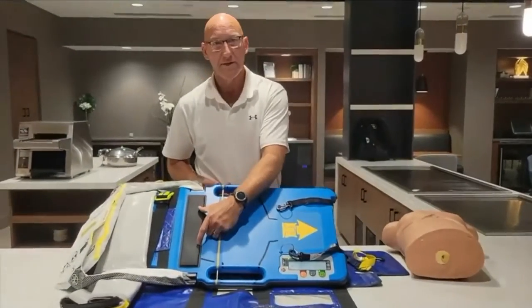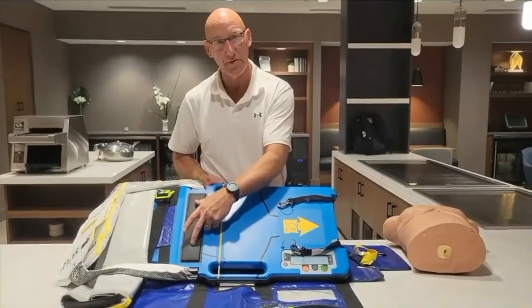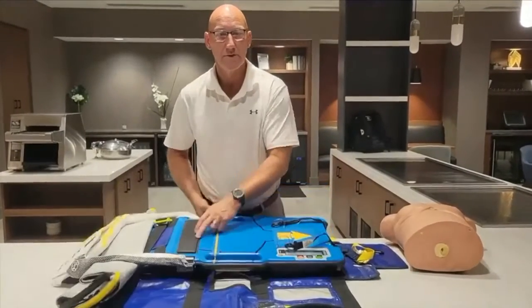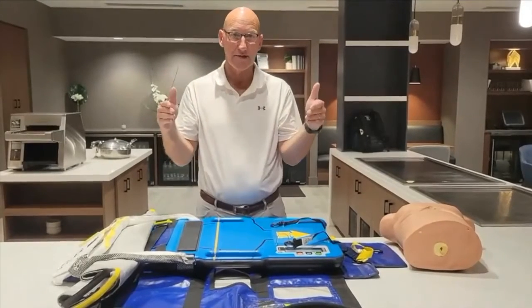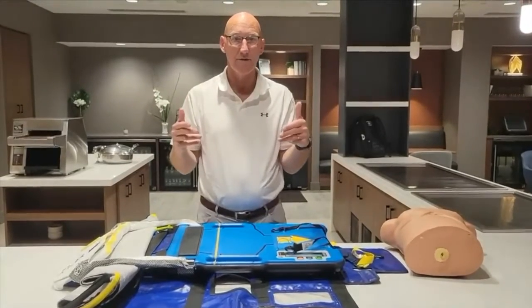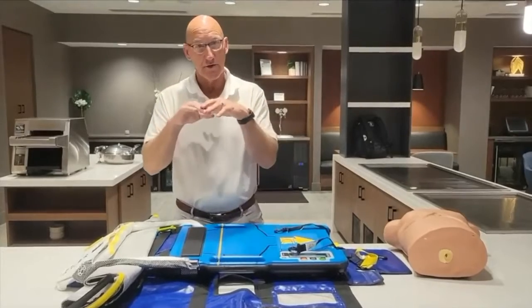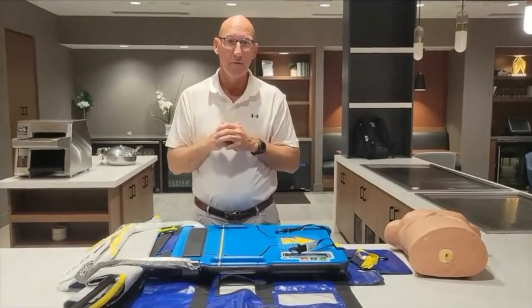One thing that sets us apart from our competition and from manual CPR is this black bar — there are two load cells in here. As that band comes down, those load cells are measuring the patient's chest. Every cardiac arrest patient we put inside this platform gets a customized compression. We reduce the chest wall circumferentially, 20% anterior and posterior.